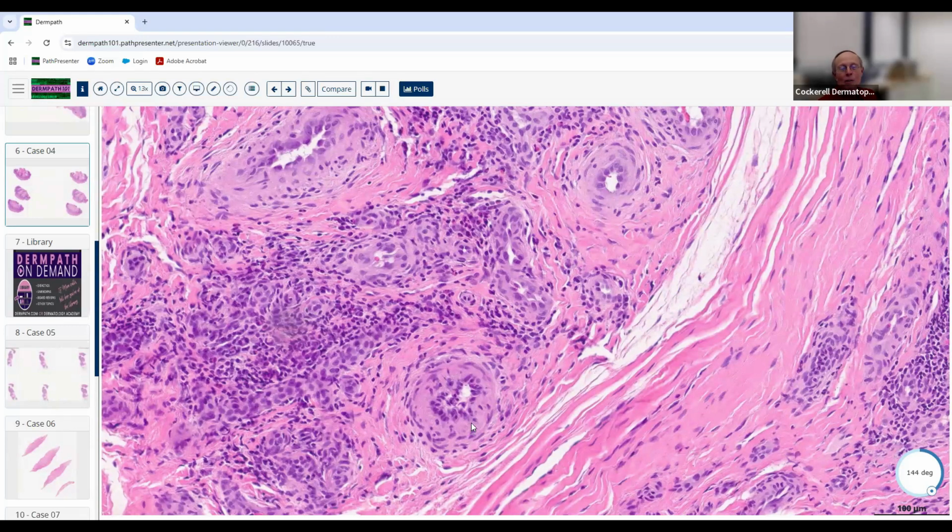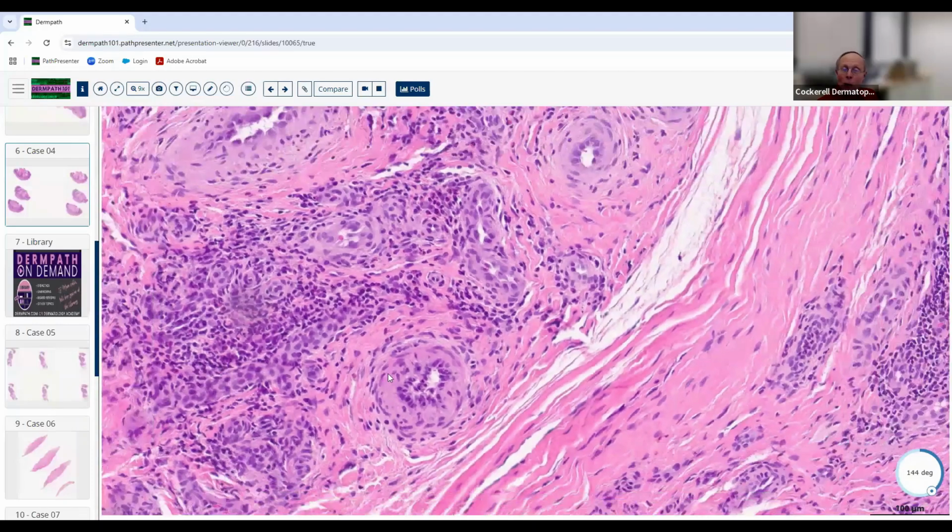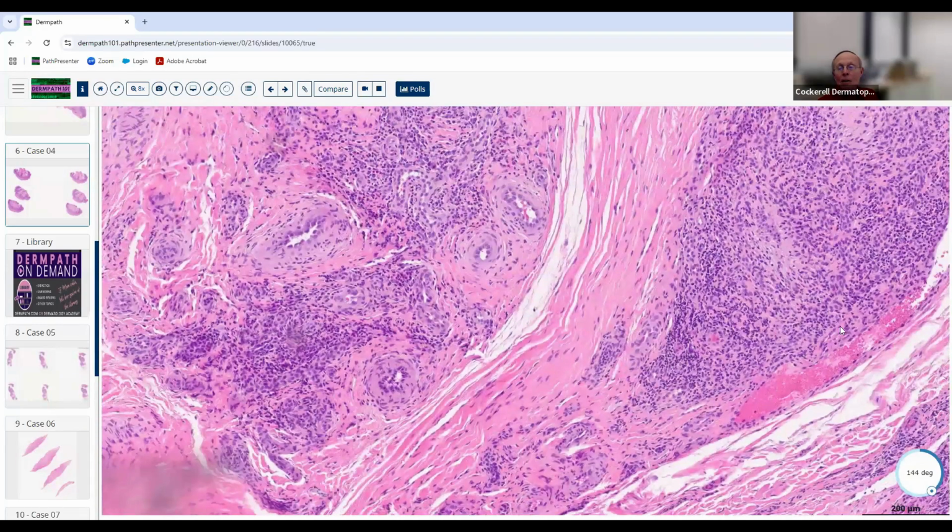That's the answer. So that's good. So when you see angiolymphoid hyperplasia with eosinophilia, first, there's a couple of things. Number one, they don't always have to have very many EOs. Now, I've seen some that have got a gazillion EOs, way more than this, but this has some EOs, so that's good. They actually sometimes will have circulating eosinophils, but not a lot in the tissue, interestingly enough.